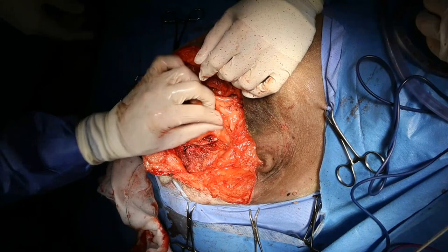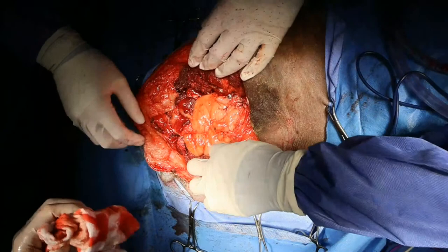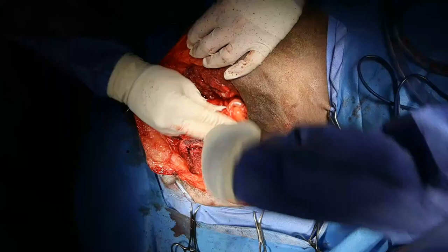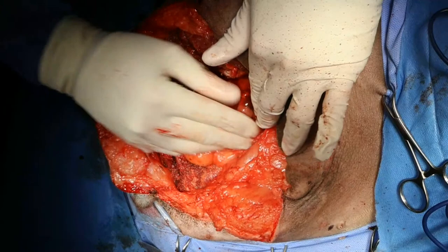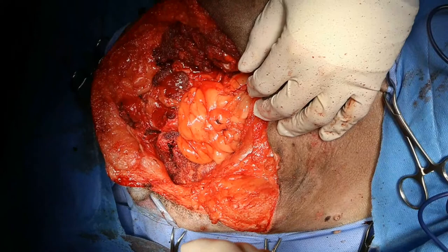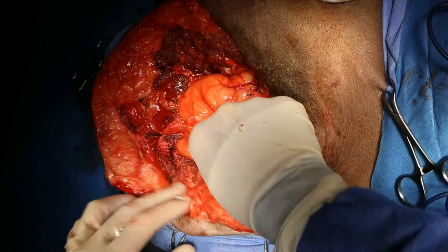Can I please get some polypropylene mesh? Okay, let's see if I can zoom in a little bit for the closure. Yeah, we can take that out. Got a little enlarged lymph node here. Could be just reactive, but we'll send that off. So can I pull that prepubic tendon all the way up to there is the question. Yeah.